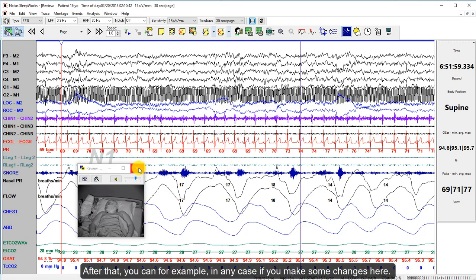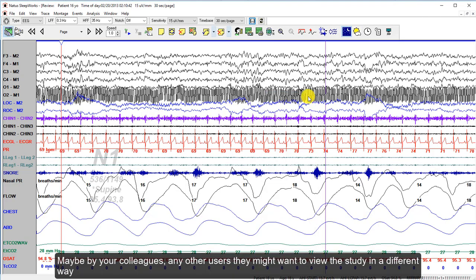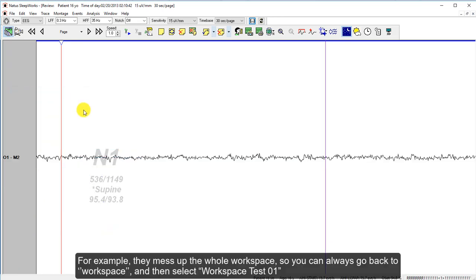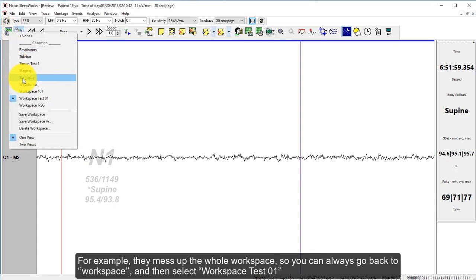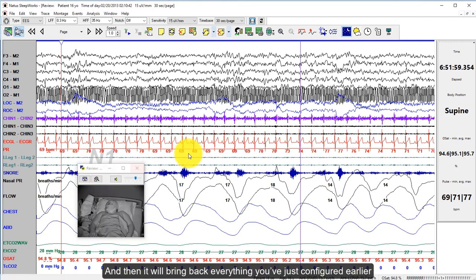After saving, for example, if your colleagues or other users change something and mess up the whole workspace, you can always go back to the Workspace toolbar and select 'workspace test 01', and it will restore everything you had configured earlier.